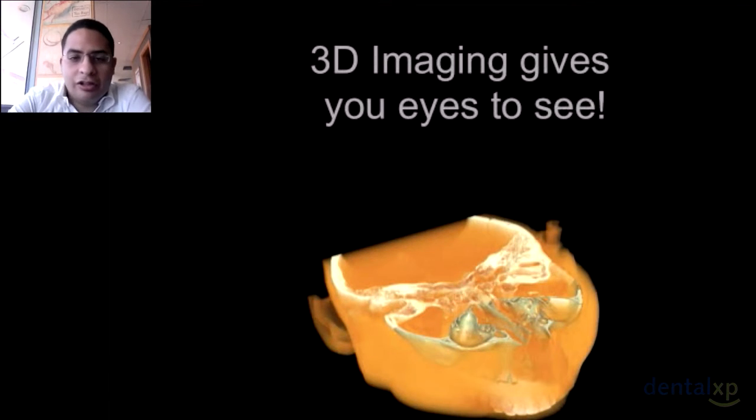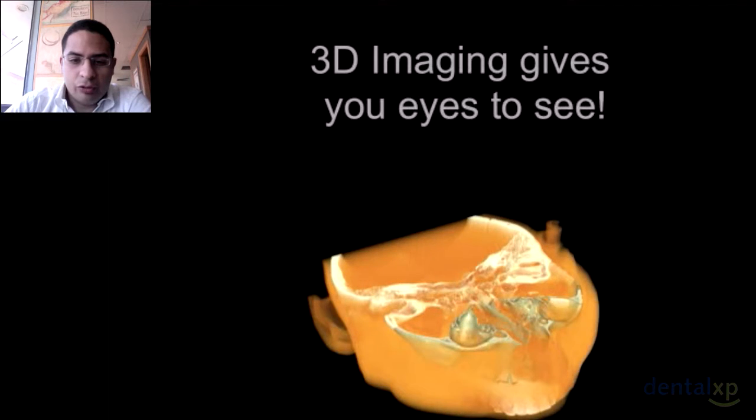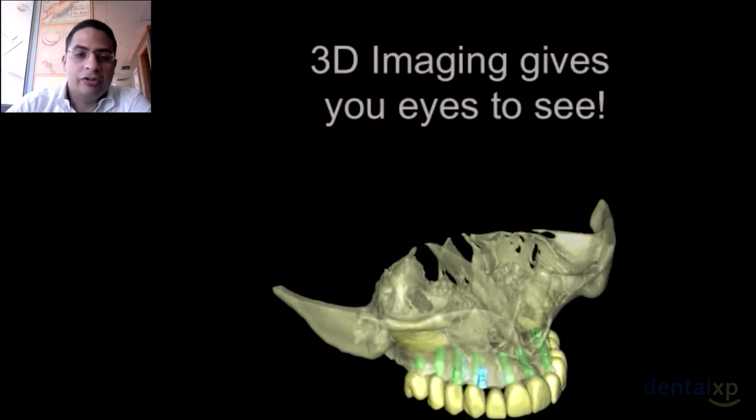Okay, I think that 3D imaging has made a real revolution, and it really gives you eyes to see. Right now, the guesswork is eliminated from a lot of diagnostic equations, and what we used to speculate now we can see. And you see this example, we can start by seeing the soft tissue. If we remove it, we see the bone. If we make the selective transparency, you can even see inside the bone with implants, sinus grafts, and the prostheses.